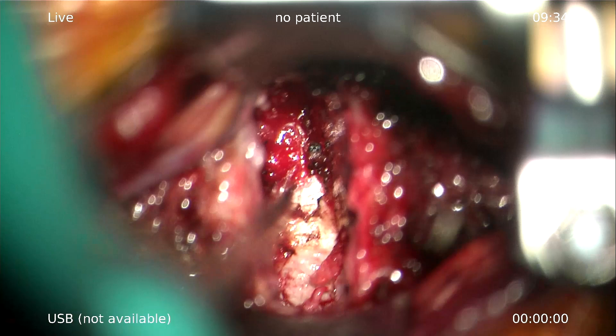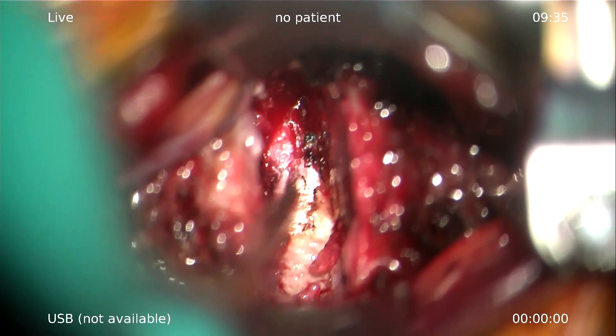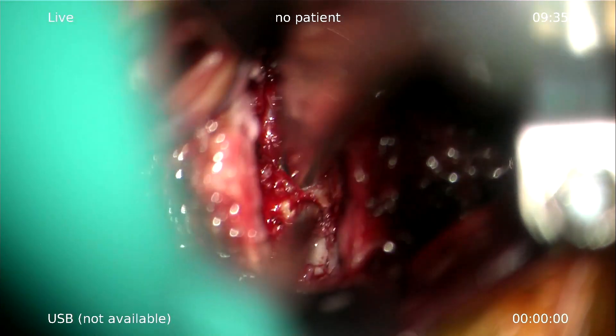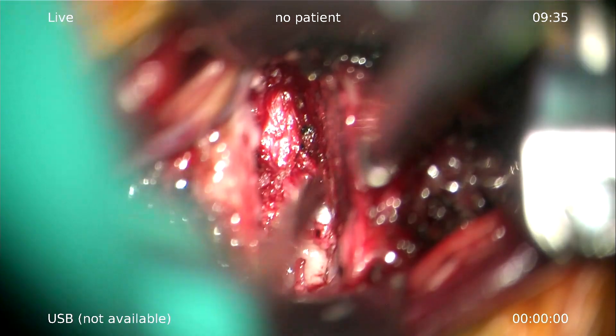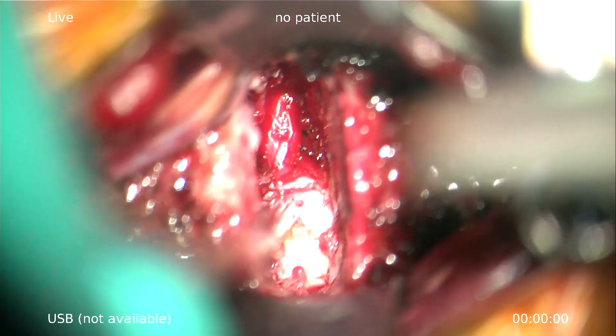You see that? Here we are — cool! Here it goes to the bottom. Very misty — the color of the dura. It's just coming up.